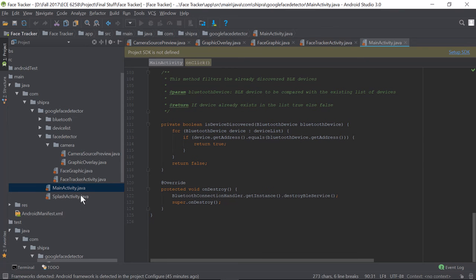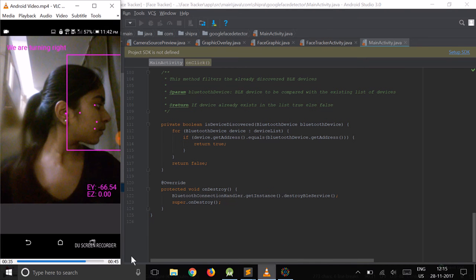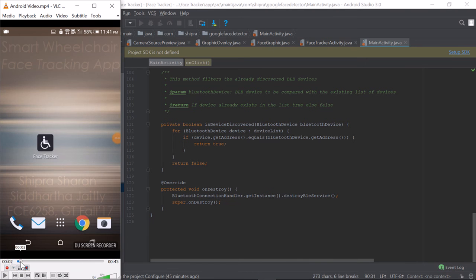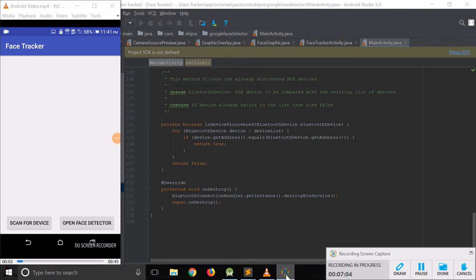The splash screen activity is basically the file which controls this part, in which this is the first screen that is called the splash screen, and this is what you'll see. So this is the overall definition of how our project works in the Android space.